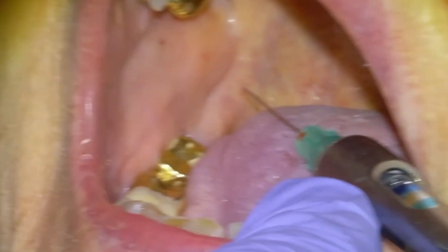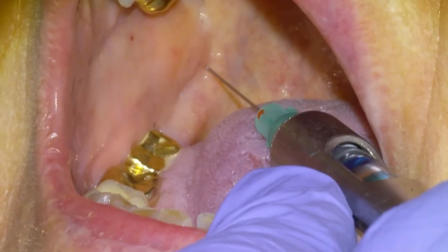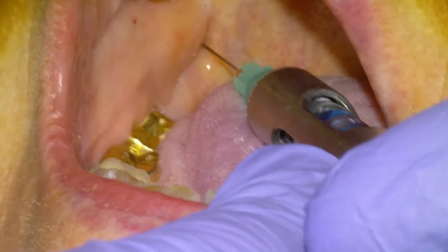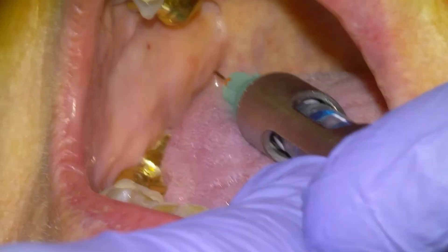Someone told me this recently: if you just give the tongue a little poke with the needle, it will retract back and flatten down. I tell the patient they'll just feel a little pinch on their tongue first and then it'll go away. That gives you about 15 to 20 seconds to do your block and get your injection done.